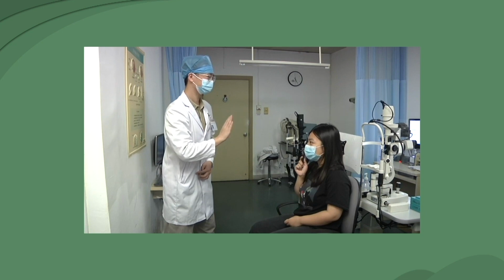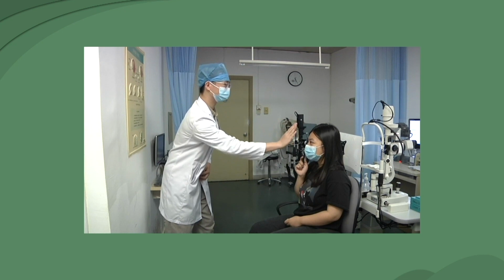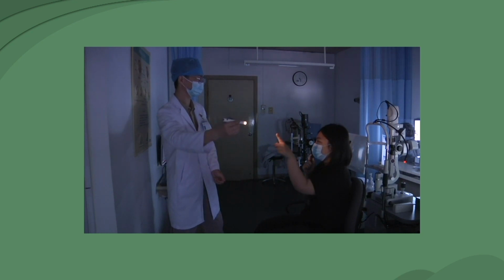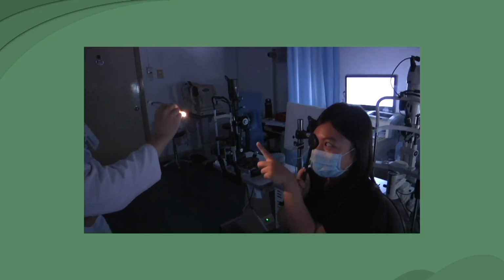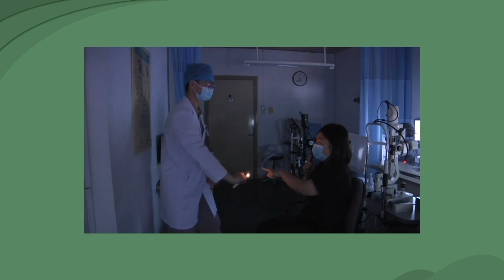If the patient cannot see and count fingers, the examiner waves his or her hand in front of the patient and records the furthest distance at which hand motion can be detected. If hand motion is still not visible, the examiner uses a flashlight to test whether the patient has light perception. Light perception should not only be checked in front of the eye, but also in the other 8 directions.